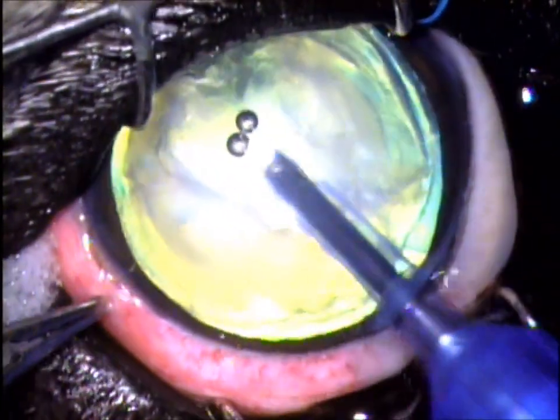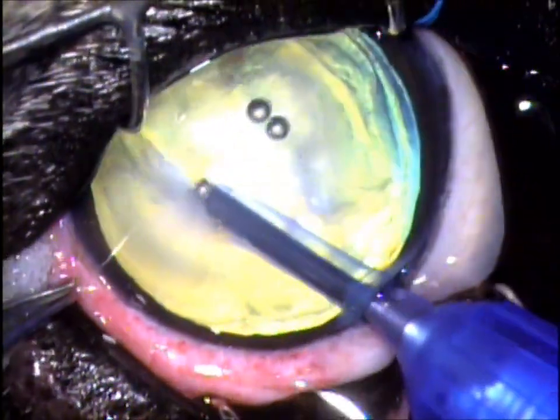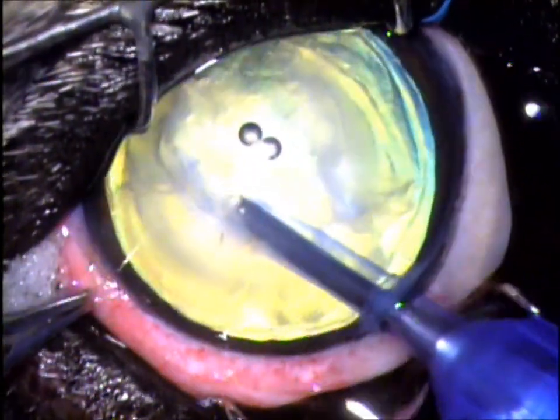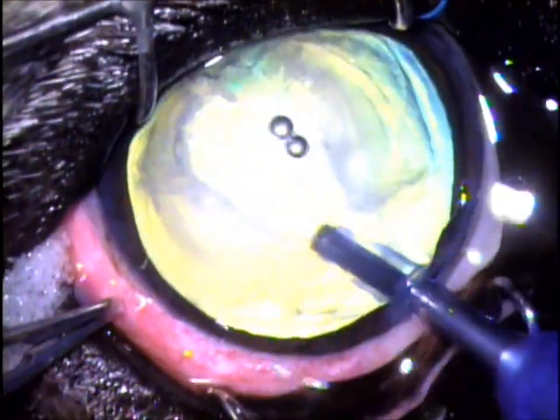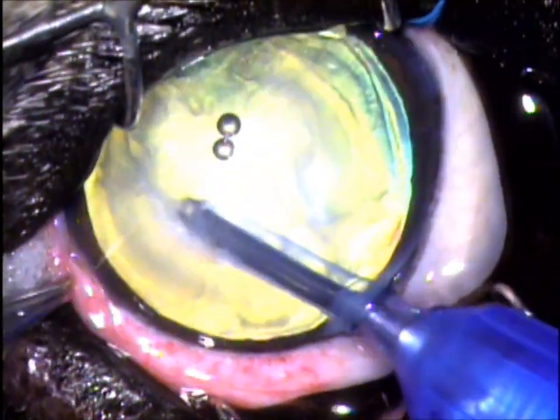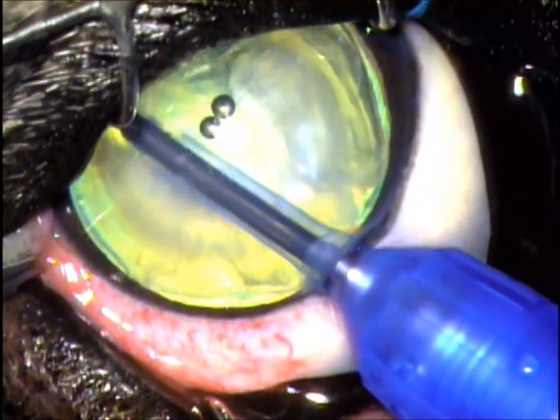We'll jump cut ahead a little bit, and here the cataract is now breaking up — there are fragments on the bottom left and the top right of the view. We're taking out the firmer nucleus, or the central area of the lens, with this probe. The two round things are air bubbles just floating around; we'll get rid of them in a minute.